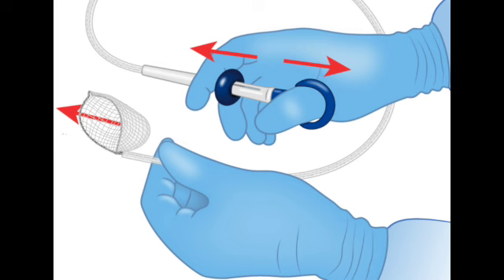Okay, so this is all very precise. Specialized tubing, filters, sterile handling. But here's the bit from the source video that, honestly, kind of blew my mind. When it's all done, and you need to get that tiny sample out of the trap for the pathology lab, the tool they use isn't some fancy, expensive gadget. No, it's fascinating, isn't it? The key tool for getting that delicate little polyp out of the trap is just a basic toothpick. A toothpick? Seriously? Seriously, a simple wooden toothpick.